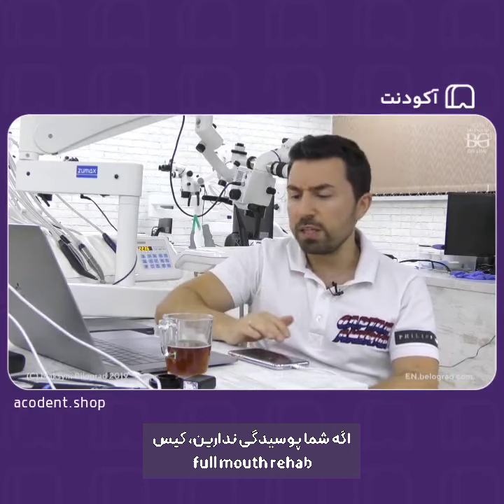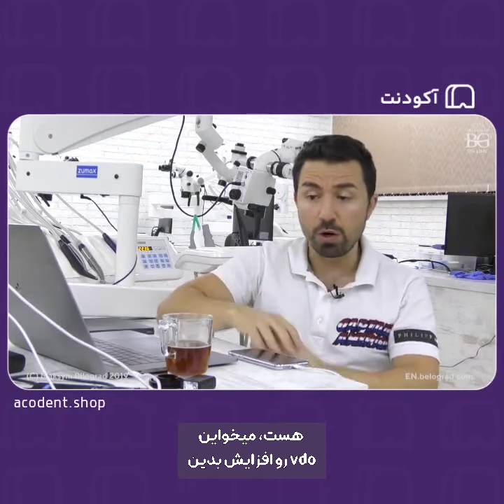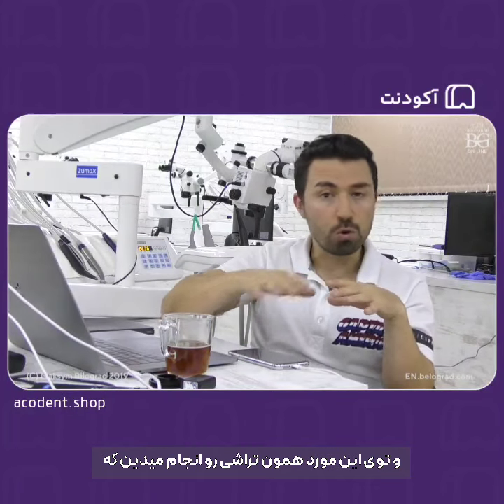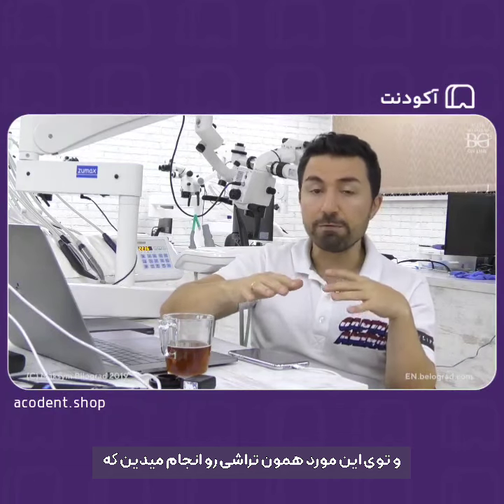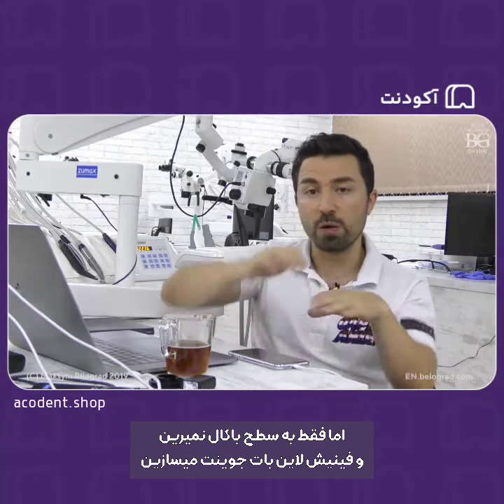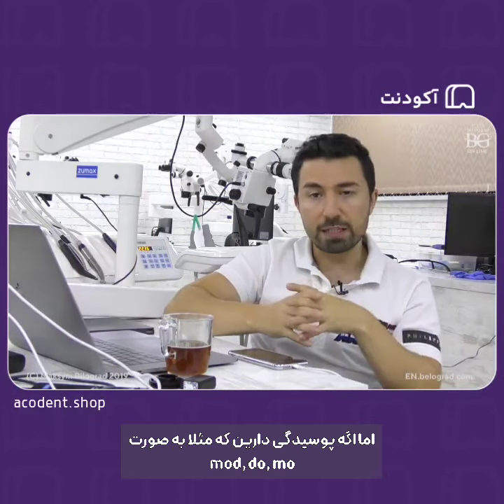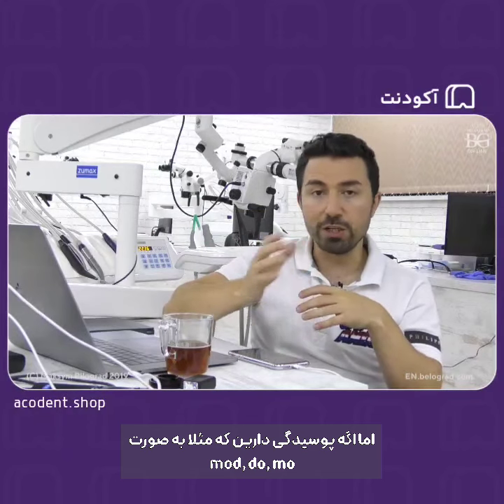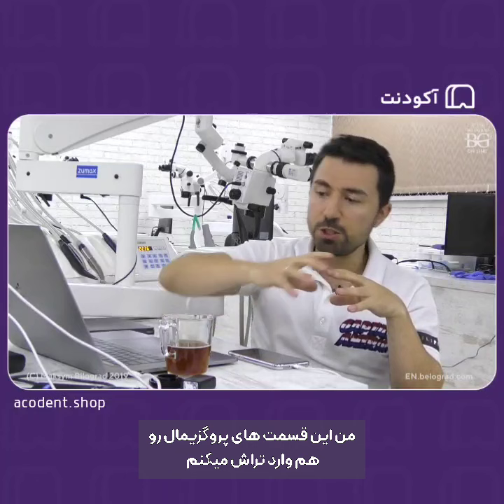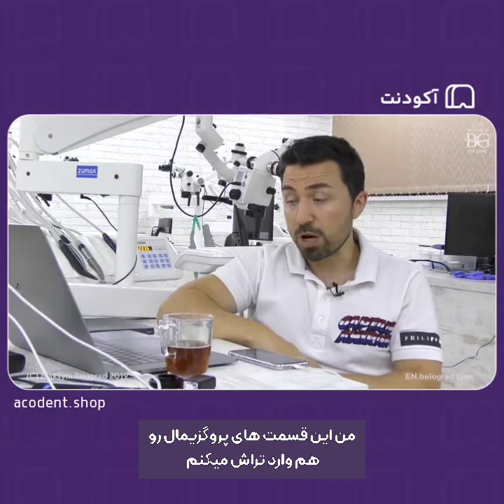If you don't have any caries defects and you do a full mouth rehab and you need to raise VDO and you have a lot of enamel preserved, that will be a tabletop. So same preparation as I did for the upper first premolar, but without going to the buccal surface. That will be a butt joint, okay? If there are caries defects like MOD or DO or MO, I will involve this part of the proximal area in my preparation.